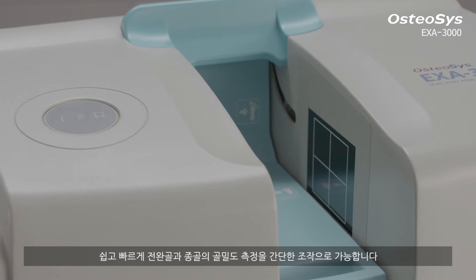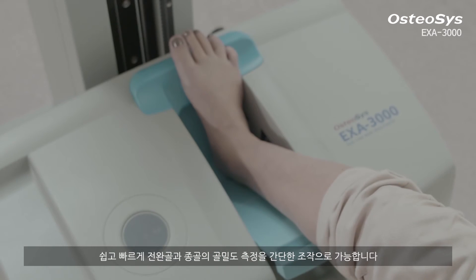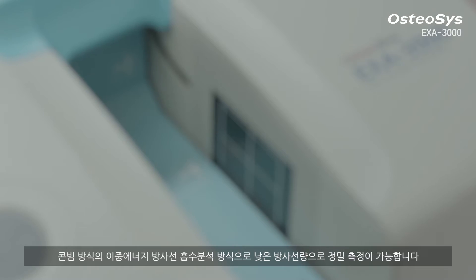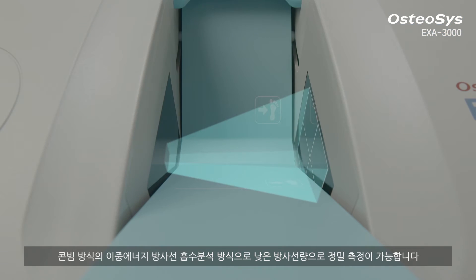With Exa3000, the forearm and calcaneus can be measured with a simple operation. It is also possible to diagnose precisely with a low level of radiation using DEXA with cone beam technology.